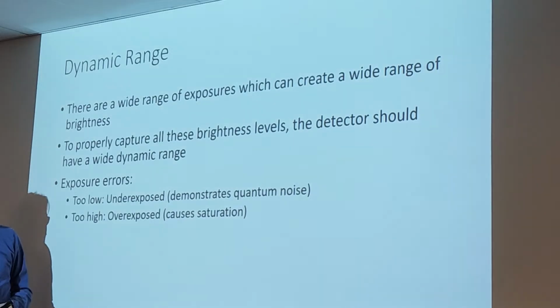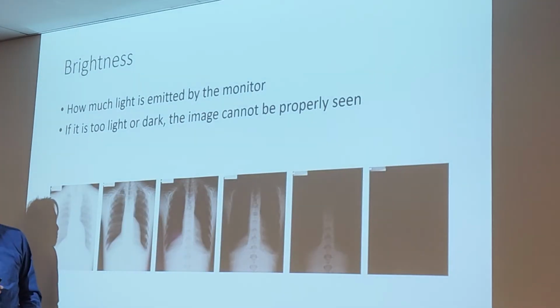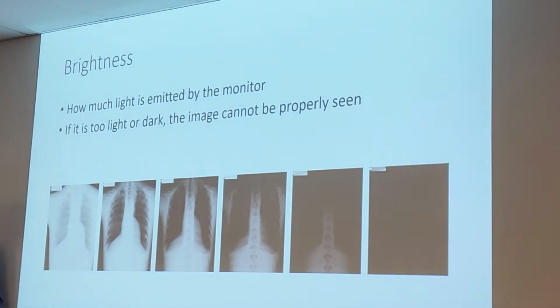Yes? Can we go back to the last slide on that note? So the image on the leftmost image, let's just talk about exposure. Overexposed or underexposed? Underexposed. Not enough X-rays? Yeah. Looks too white. How about down here on the other end? Overexposed. So it looks too black.